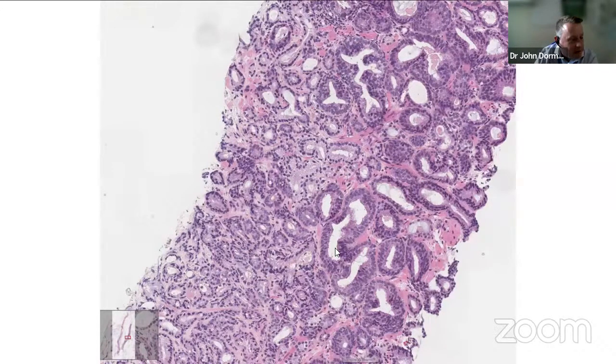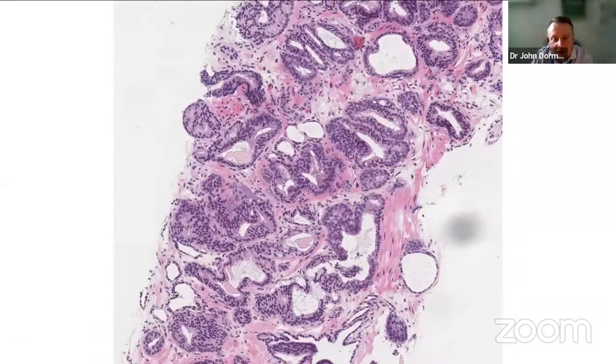And this is a close-up of the bottom core, which looks more dense. There's some abnormal glands back to back, traversing the core very tightly, clustered together. There's some eosinophilic nucleoli when you look at high power. It's possible some crowding of glands. You wonder if they're separable by stroma or not. Okay, thanks, Nick.